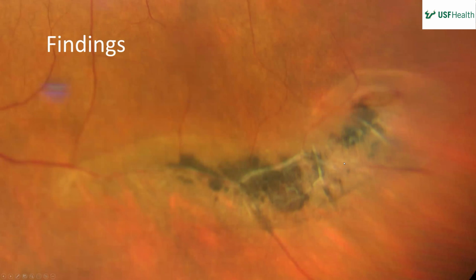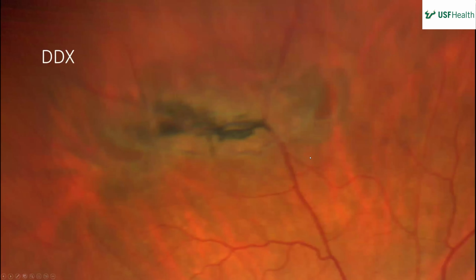Dr. Cohen, those little white lines, is that almost like a snail track? Which ones? Those white lines we thought were the vessels. Yeah, those are sclerotic vessels. If you follow those, you'll hit a vessel. And the way they crisscross is supposed to look like a lattice. So that's a way to remember it. It looks like lattice work.